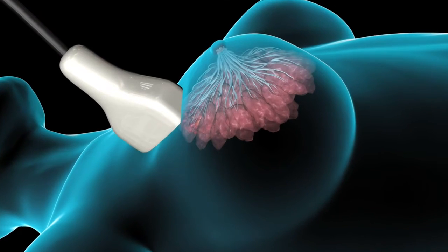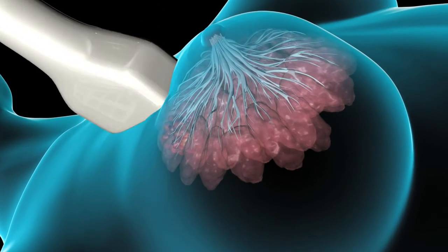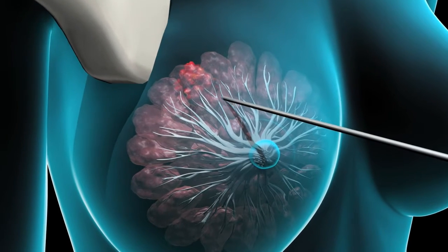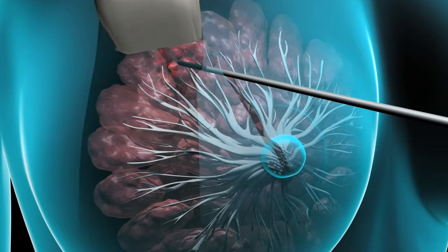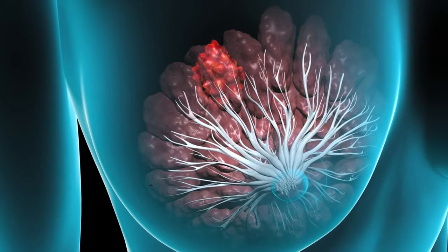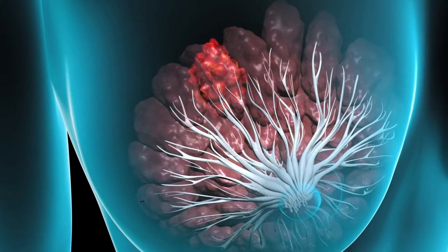Ultrasound-guided core biopsies can be performed when your breast lump is detected on ultrasound. In this procedure, your physician will use an ultrasound probe to locate the mass and insert a hollow needle to remove several cores of tissue.